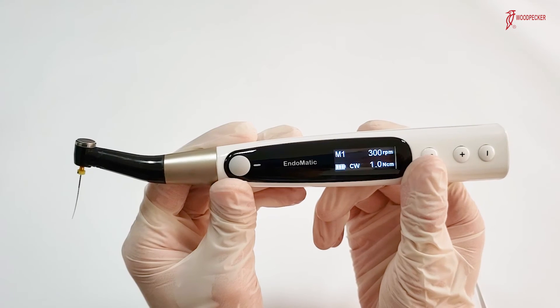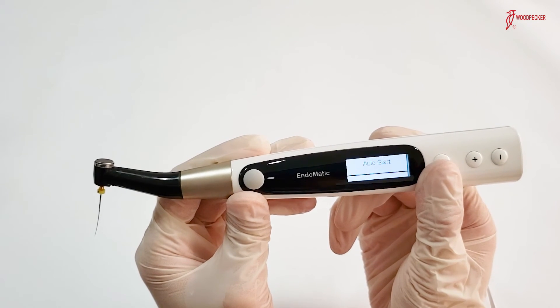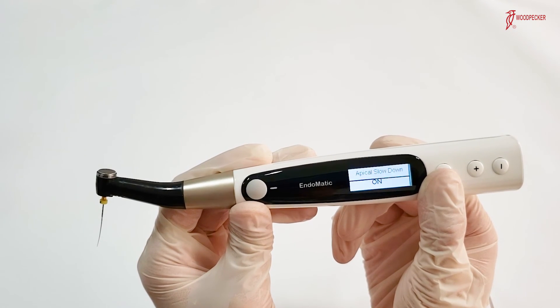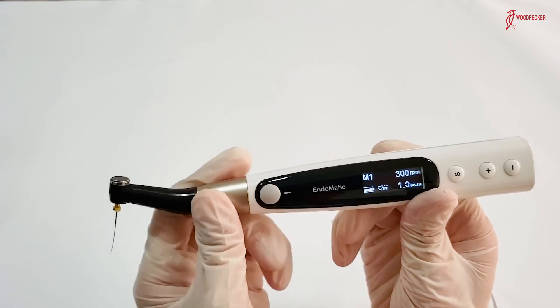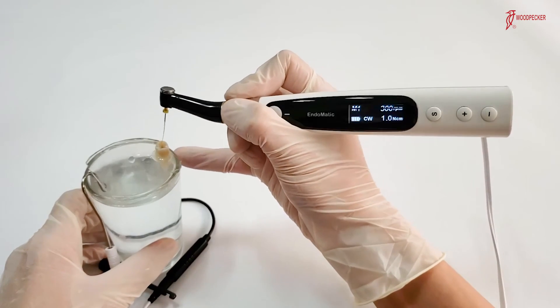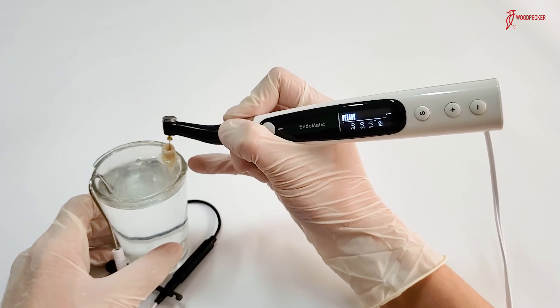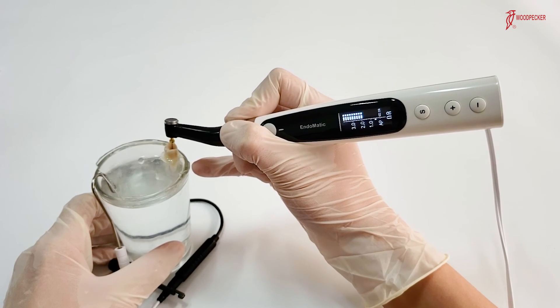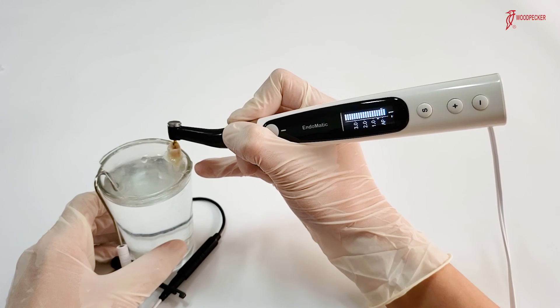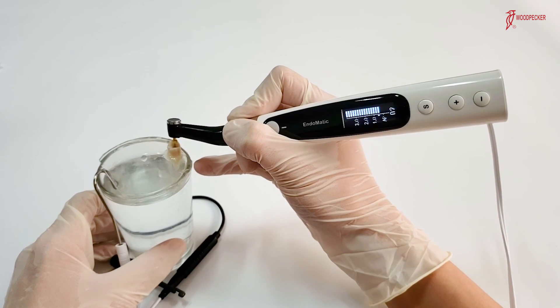Now let's select settings: apical action set to reverse, auto start switched on, flash bar position set to physiological apical foramen, and slowdown switched on. Then let's try the device. Here is the simulator — you can see that when I put the file into the root canal, it works automatically. When the file approaches the apical foramen, you can see the speed reduce. When it reaches the apical foramen, it reverses automatically and gives out an alarm.